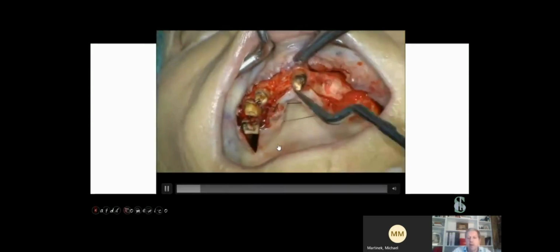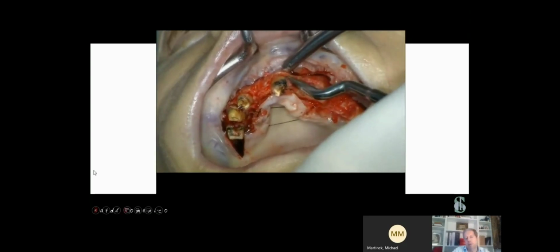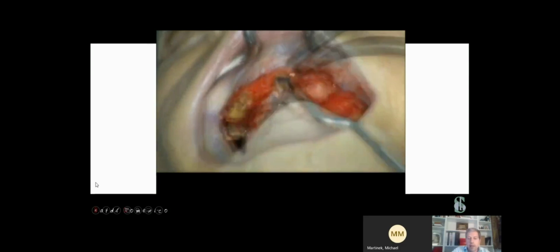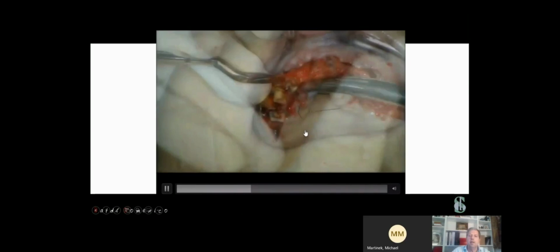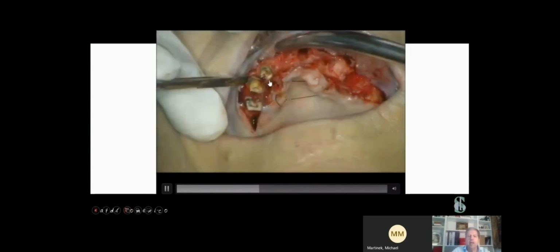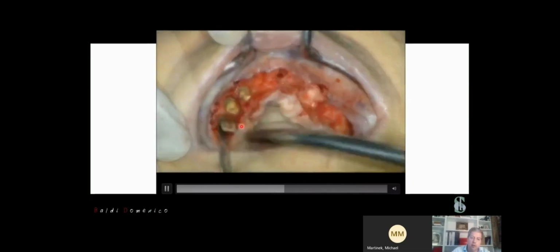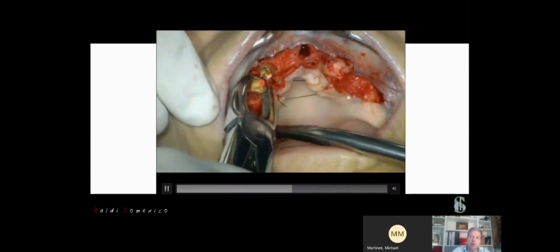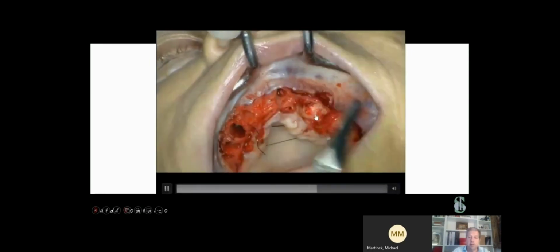Look at here. We work in a very, very gentle way, but when we finish, unfortunately, we obtain a damage of the bone because we had ankylotic bone. Look at here, we had a damage. On the other side, we use the osteotome and also the magnetic mallet. And look at here how it's possible to manage our instrument also in the buccal zone, without damaging the bone, maintaining the integrity of the bone. So with the forceps, we can make the extraction of the tooth without damaging it. And then we obtain this kind of result.